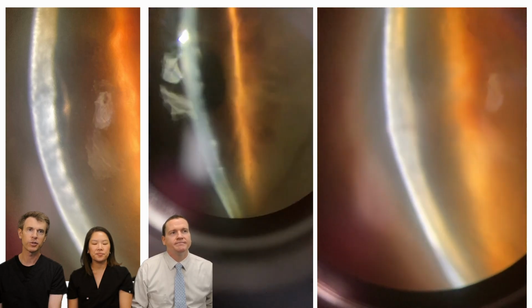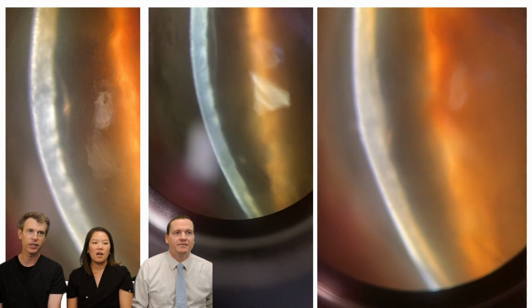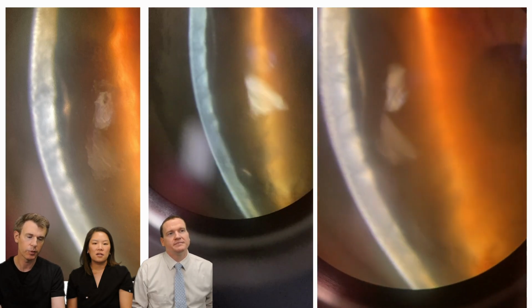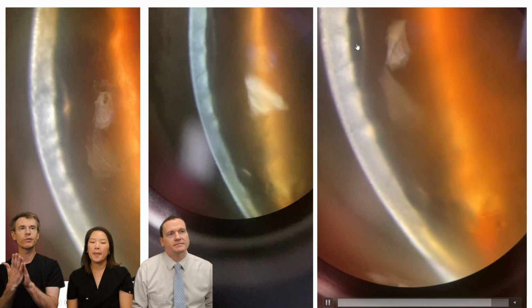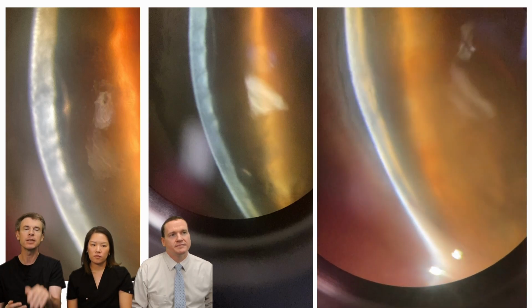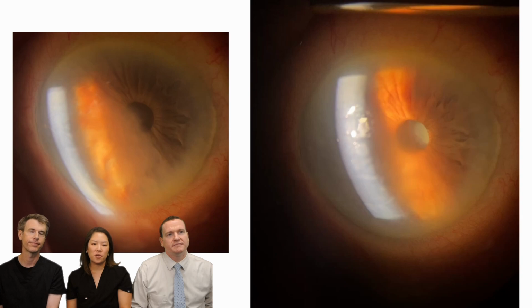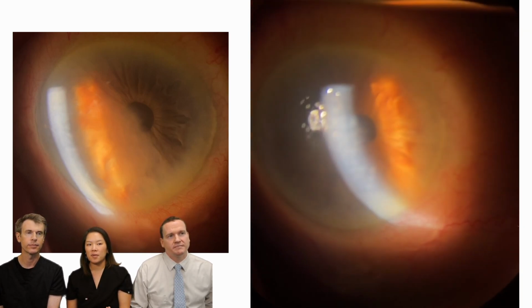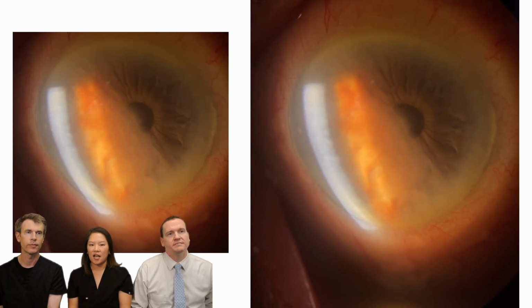Yeah, so I get the question, where is it attached? I was like, if it's clear, it's not detached. If it's swollen, there's a high chance that it's detached. OCT will help you isolate a little bit more, and here in the higher magnification, you see that wave a little bit better. But please, very high illumination and the thinnest beam slit you can get to see that little reflection. And just to note, it is very normal for the peripheral cornea to have edema. As long as the area where the graft is clear and doesn't have edema, it's okay.